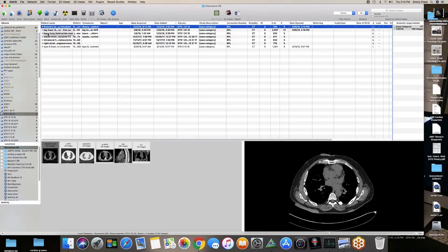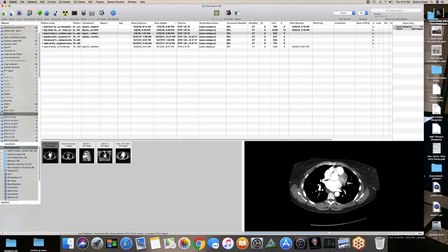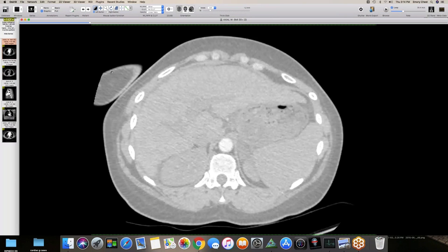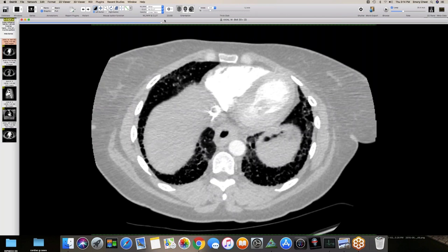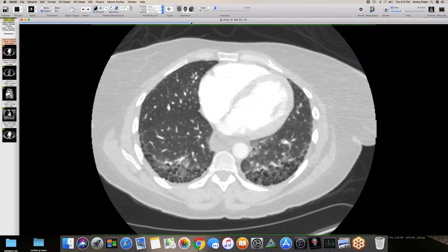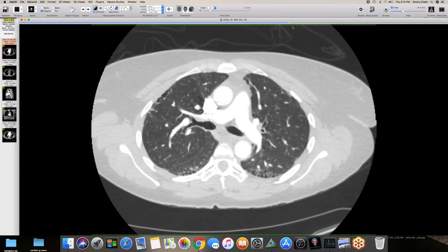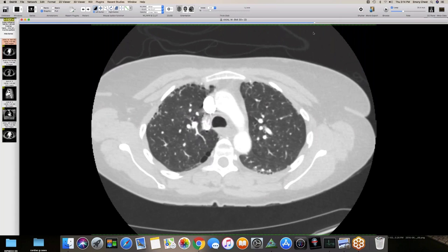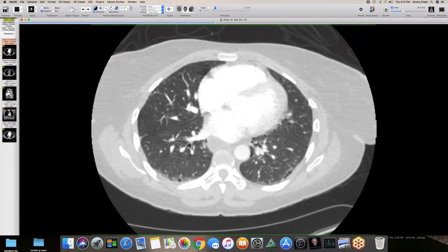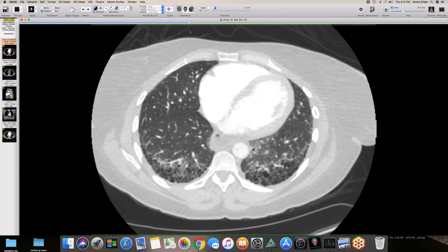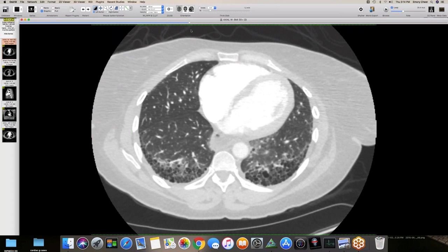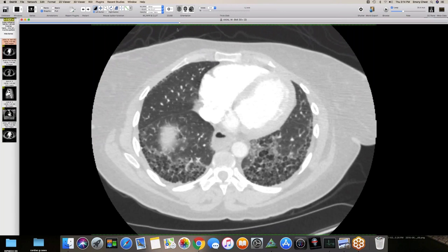This is a case of a patient in her early forties. On the lung windows, in the upper lobes there is some peripheral abnormality that is more anterior predominant. Scrolling down to the lung bases, there are well-defined areas of fibrosis and regional areas of what we've been calling a lung destruction-type pattern.